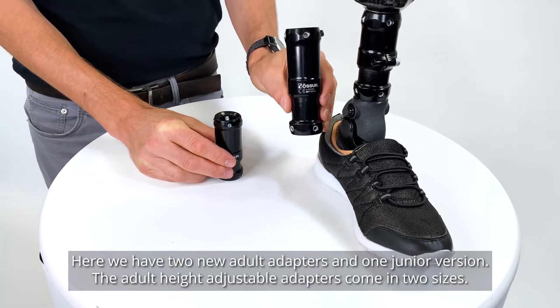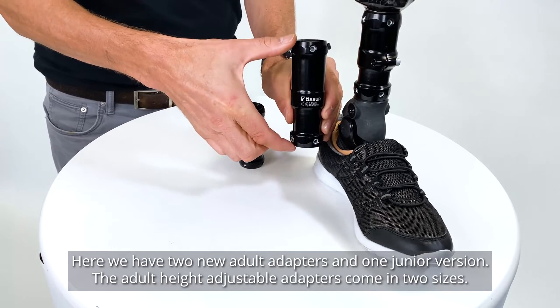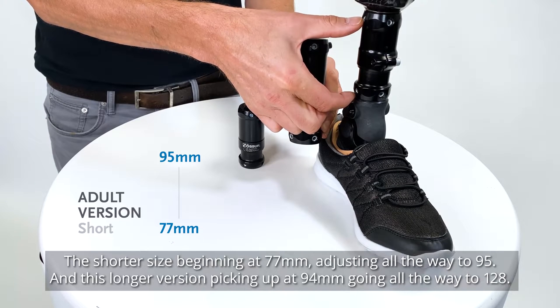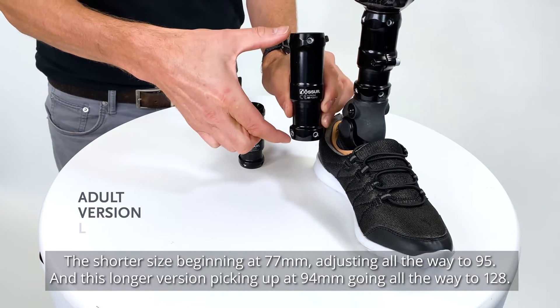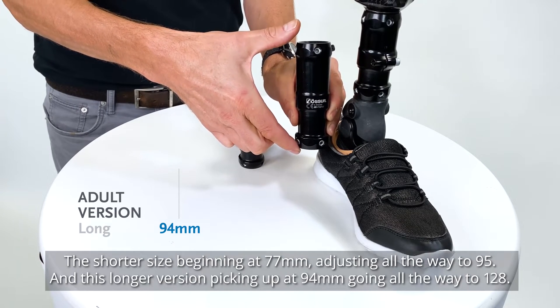Here we have two new adult adapters and one junior version. The adult height-adjustable adapters come in two sizes: the shorter size beginning at 77mm, adjusting all the way to 95, and this longer version picking up at 94mm, going all the way to 128.